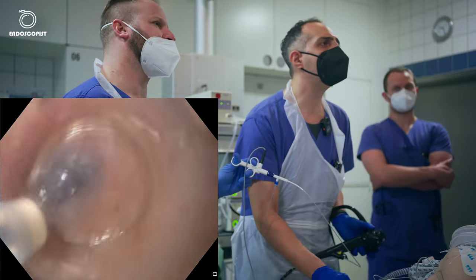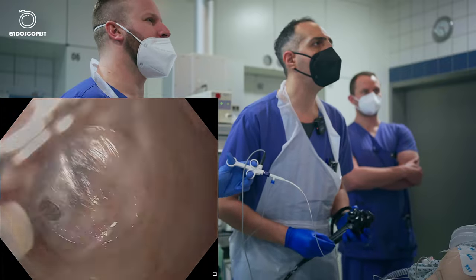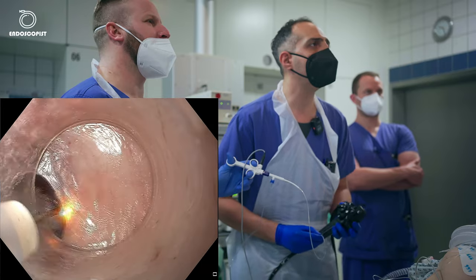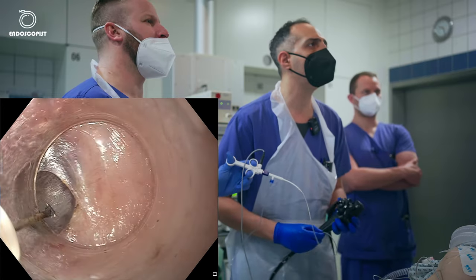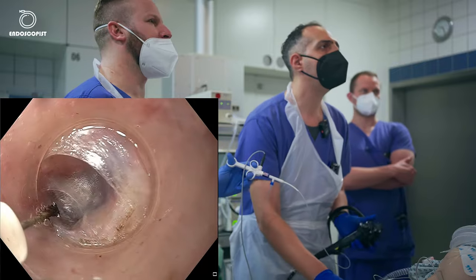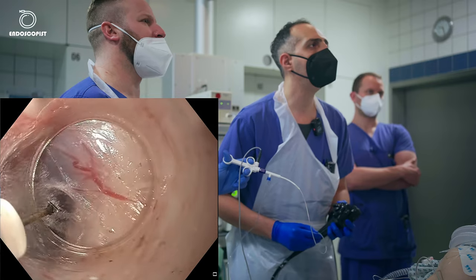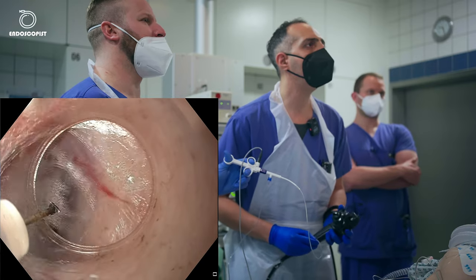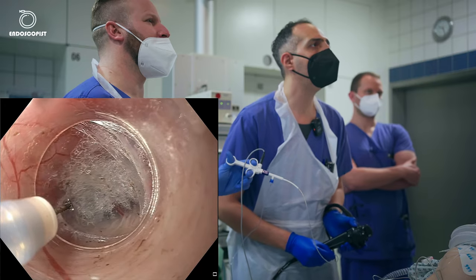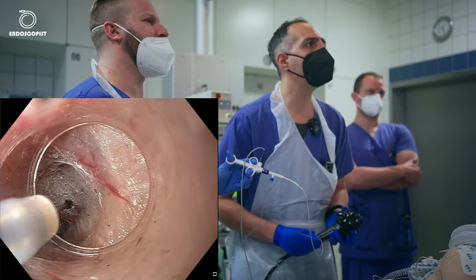Right. So I will try to go through this with the cap. As you can see, the physical traction in the cap is very helpful. Sometimes it's more than enough to go a couple of centimeters downwards. So here. That looks nice. There's a big vessel here, we have to take care of it.